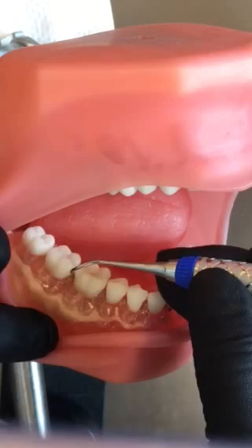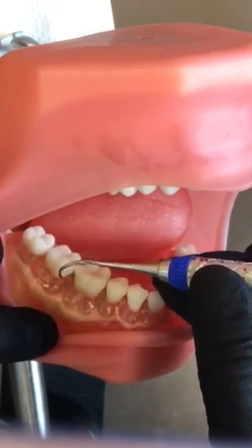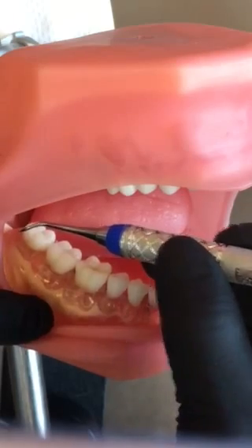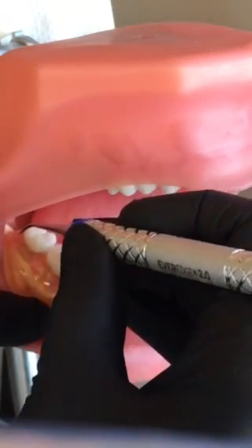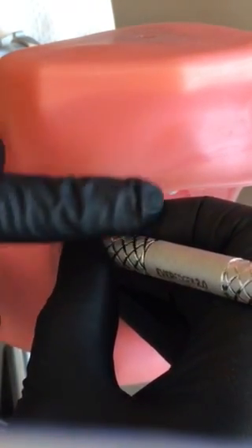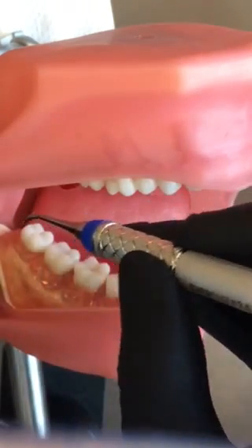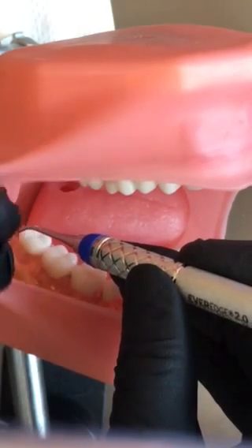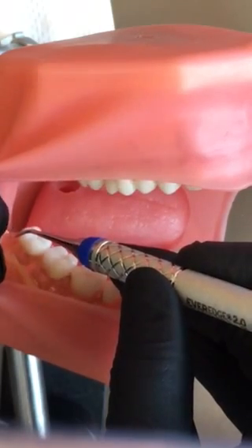The angulation is the same as it is on the 204S Scalar. You're going to start with your most posterior tooth. Notice I can't fulcrum on number 30 to use the instrument on 32, because on a real person this is what I'm going to see. So you want to establish your fulcrum — you have to slide back on the handle just a little bit to get the reach, so you can still gently retract with the mirror and see what you're doing.